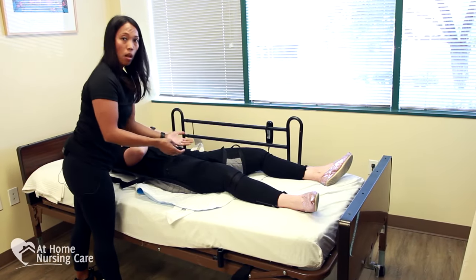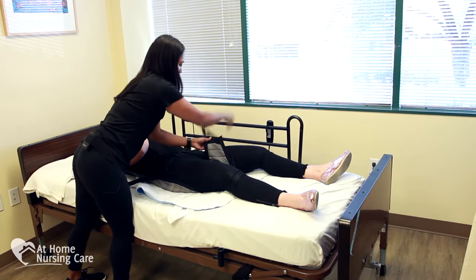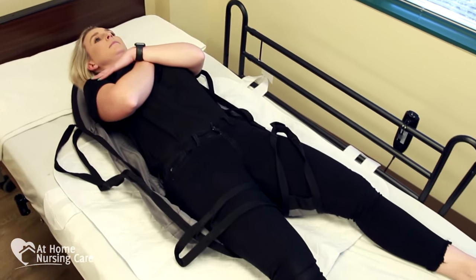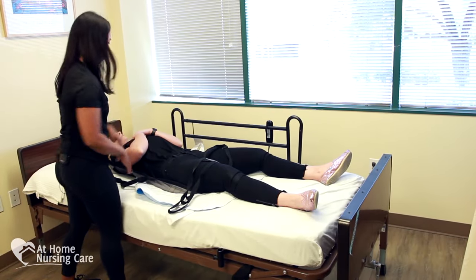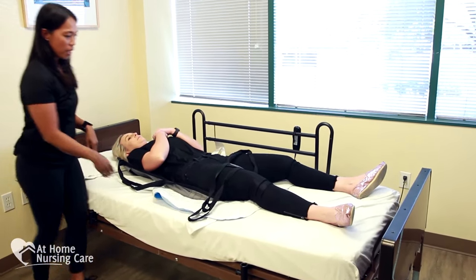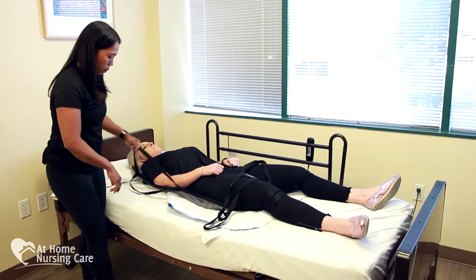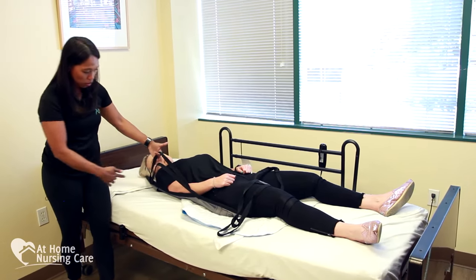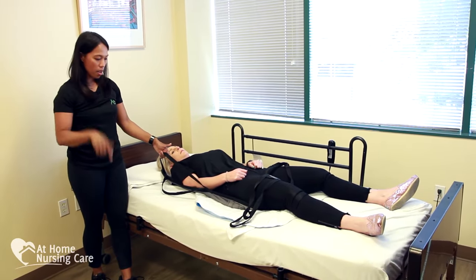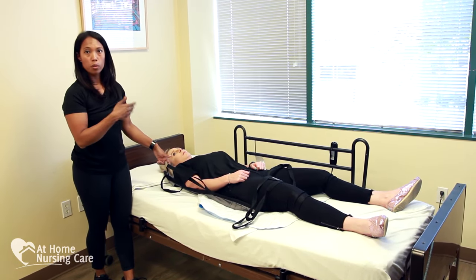Once we've had the legs underneath, make sure there's no bunching of the sling. We want to do a cross-lock method — you feed the leg piece through and it just crosses and locks. Are you comfortable? Nothing's bunching? Once we're ready with the sling, the base of the spine is at the very bottom and the head is at the top. There are two loop options: the longer loop allows her to recline back with head support, and the shorter loop positions her closer to 90 degrees. Today we're going to use the shorter loop.